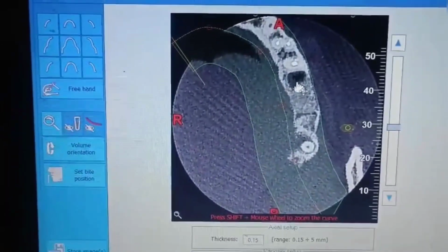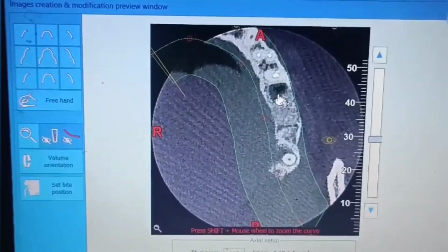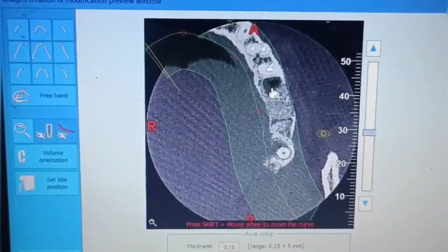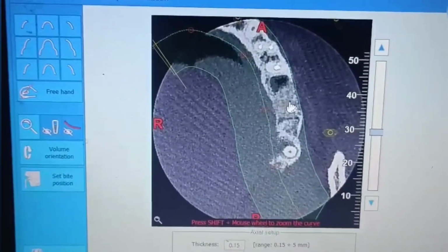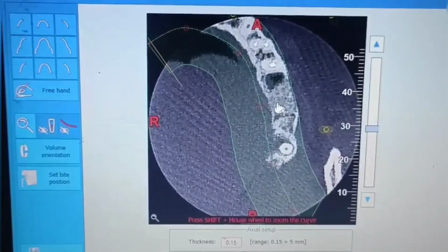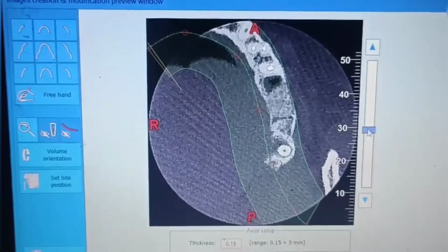you can see the sinus floor. That means the sinus floor is very deep, or the depth of the sinus floor is more in the ridge of this area next to the premolar region. So in that area you cannot place an implant. But here you can have the area distal to the 6, the 6 and the 7 region. It seems to have very good bone, at least in its width. Let's see how deep the bone is when you go still further apically to that first molar region.